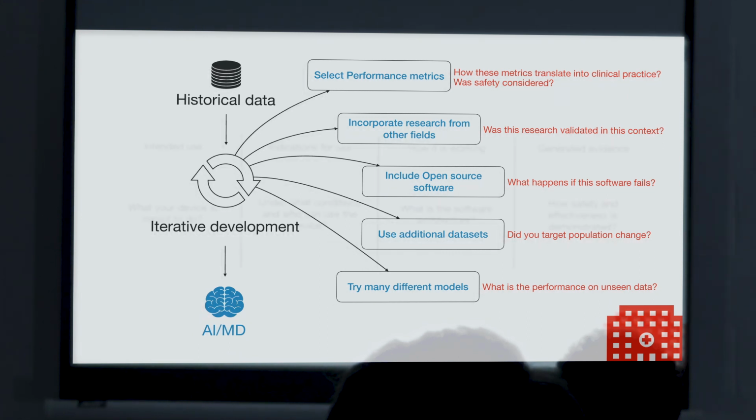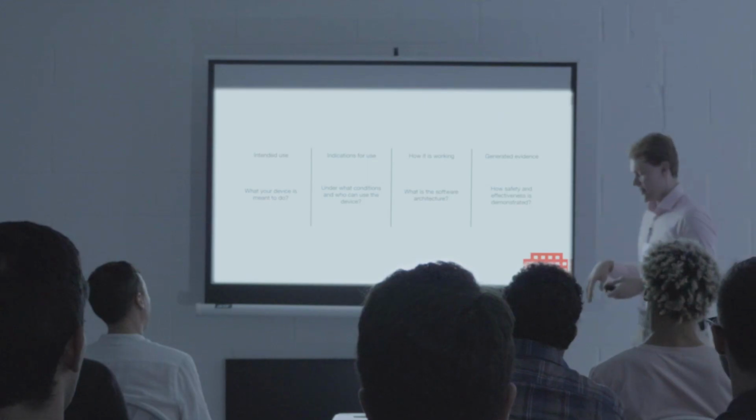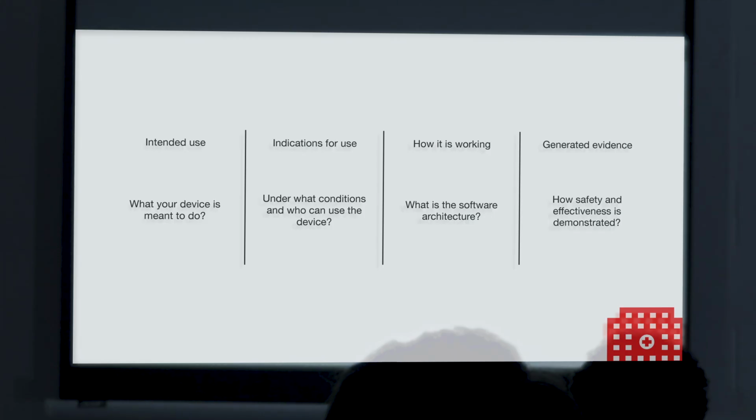So this is how regulators usually formalize these concerns they have, and what topics we need to address when we develop the medical device. So let's talk about intended use. You have to be very clear to define what your device is meant to do.